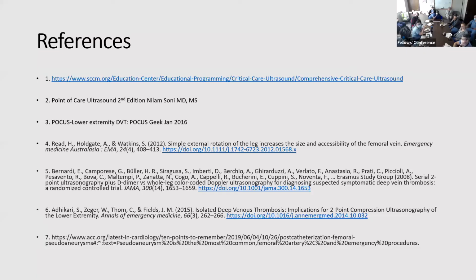If you find one on your own bedside exam, do you feel comfortable enough just anticoagulating? I personally do. Sydney and I found one in the emergency department. Clear DVT. We started anticoagulation and got a formal study, and the clot was gone. But we will continue anticoagulation anyway. Okay, so I think if you're a fellow and you're worried about liability, I would always get a formal study. But once you've done this many times, and of course we left a picture in the chart, I'll start it right away.